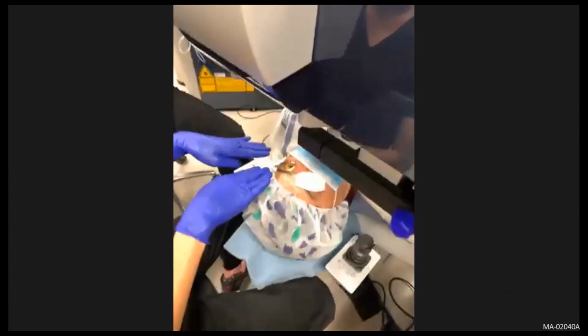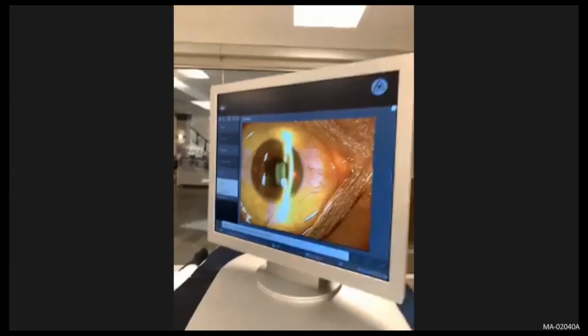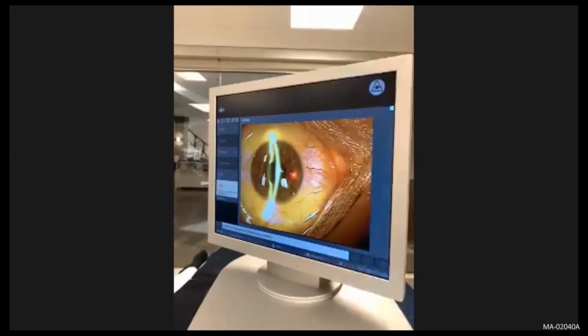Okay, hi everyone. So we're fully saturated, and if you look here, we have a slit lamp. This is actually our LASIK set, our wavelight suite, but we're using this slit lamp here, and you can see our patient. He's fully saturated with the Photrexa. So we're going to pan up to the monitor there, and I'm just taking a look at his cornea.